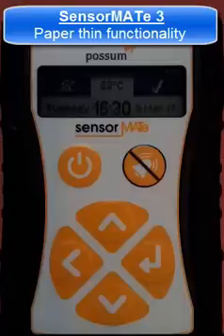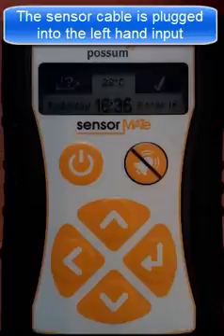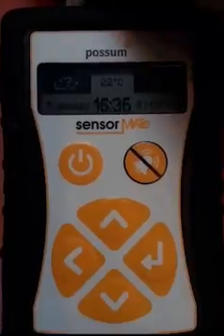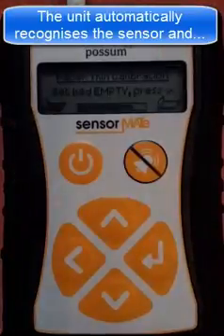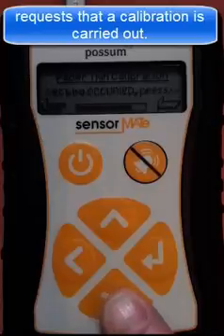This is a short video explaining the Sensormate 3 paper thin functionality. The sensor mat and interconnecting cable is plugged into the left hand RJ12 input. The unit automatically recognises that the sensor has been inserted and will then request that the installer carries out a calibration.